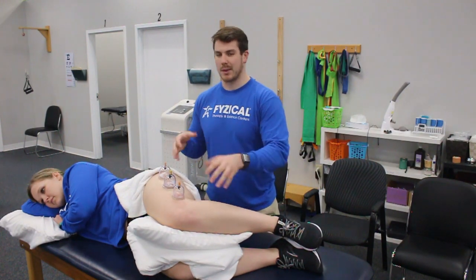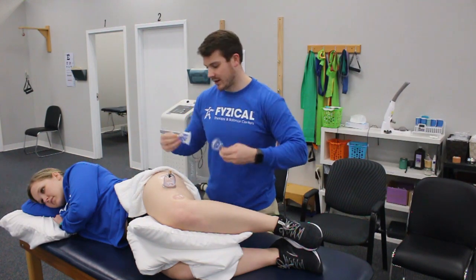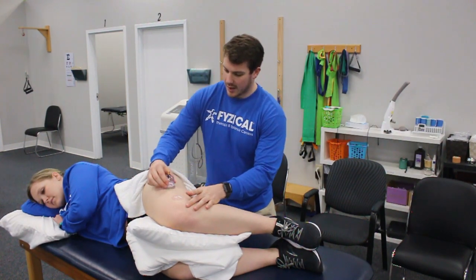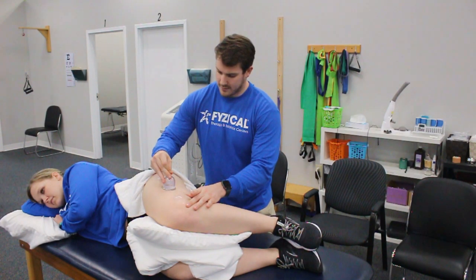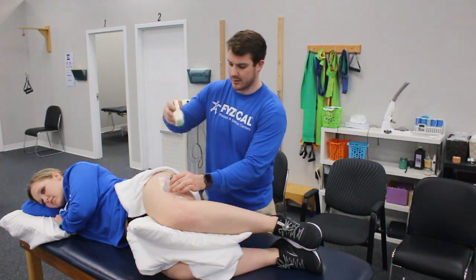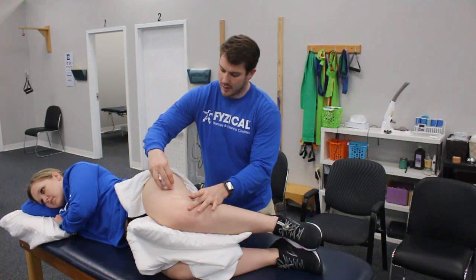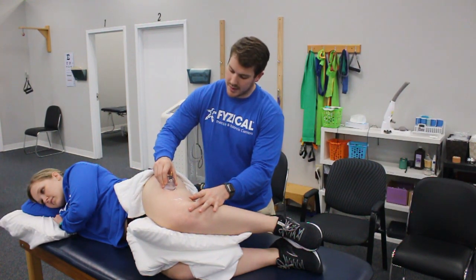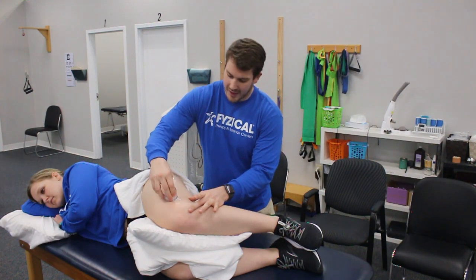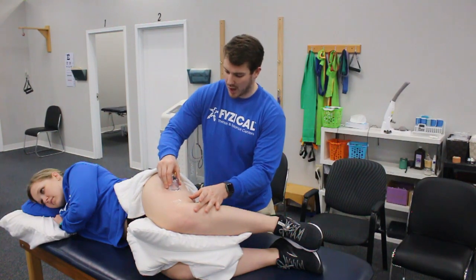Just let that rest — sometimes I'll leave it on a little bit longer. Then like before, I'll take a few off and just nicely glide one of them. We lost a little bit of pressure so we'll add a little bit more. We're just moving up and down that band of fascia that is tight on a lot of individuals and can cause problems.